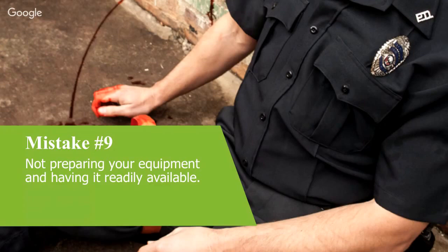I guess this is a point that goes much further than the arterial tourniquet. I mean, this goes for all your kit. As a generalization, you want to lay your kit out medically with regards to when you're going to need it, and think about your MARCH protocol or whatever primary survey or response protocol you're working off, and think about laying your kit out with access to the kit in that order. So it's your massive hemorrhage control stuff that you need close to the surface. I've seen a couple of comments talking about having to be able to put it on yourself. Absolutely, that's worst case scenario, but think of it that way with your tourniquet.